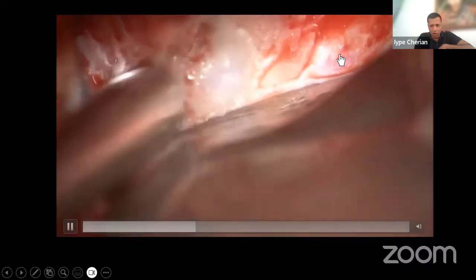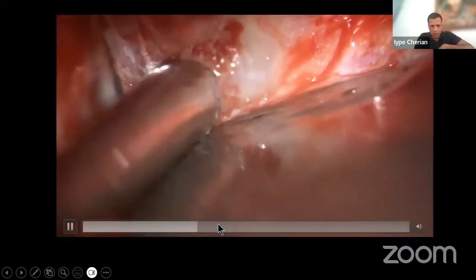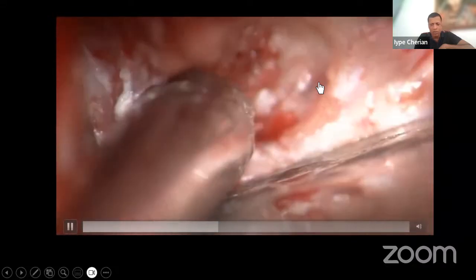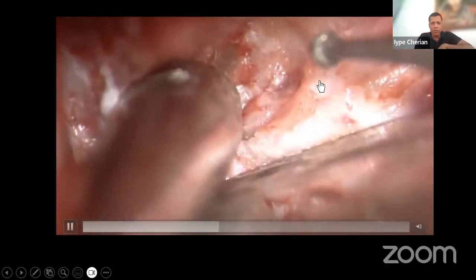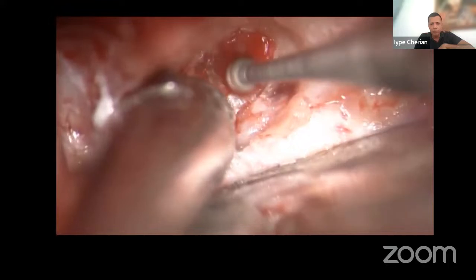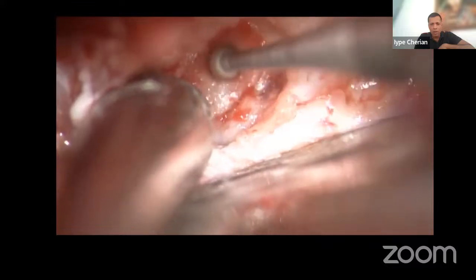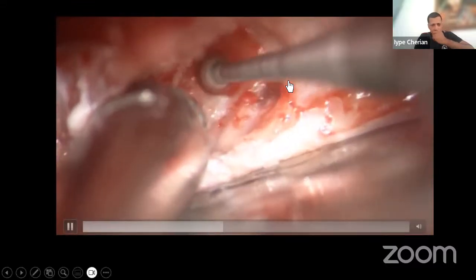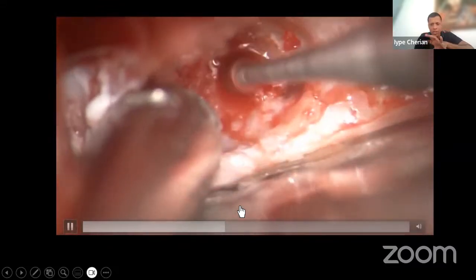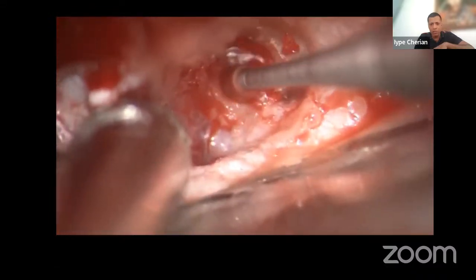So the aneurysm, that is the optic nerve roof. It is drilled out. And this is the clinoid, and that is where the aneurysm is. And that's the aneurysm. So when we are drilling, you can see the aneurysm through the bone. And we are using a 0.75 millimeter drill now. Drill off the entire clinoid extradurally just over the aneurysm. The dura is protecting the drill from touching the aneurysm.